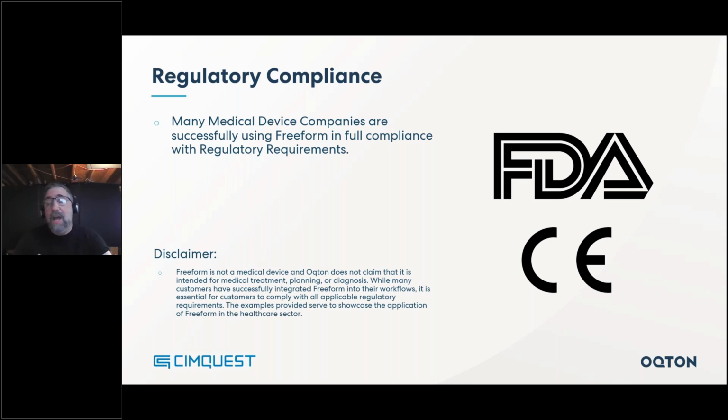I have to do this. This is part of my job. So for the sake of just taking a moment, regulatory compliance: many medical device companies are successfully using Freeform in compliance with regulatory requirements. Freeform itself is not a medical device, and we don't claim that it's intended for medical treatment, planning, or diagnosis, but it can be integrated in a validated workflow as off-the-shelf software.